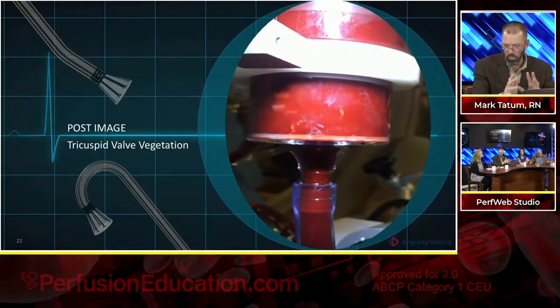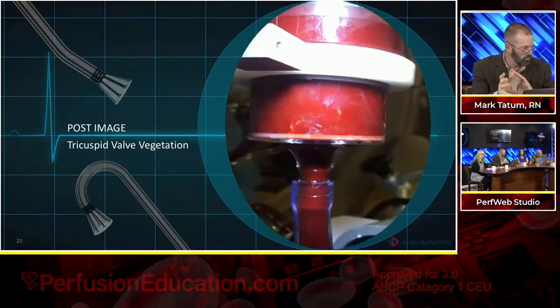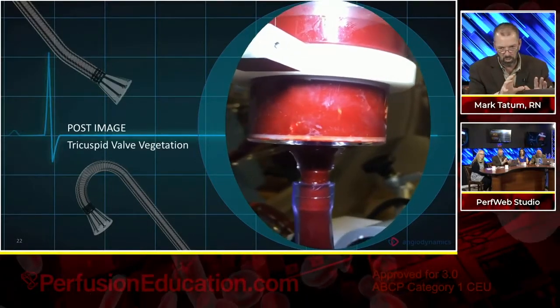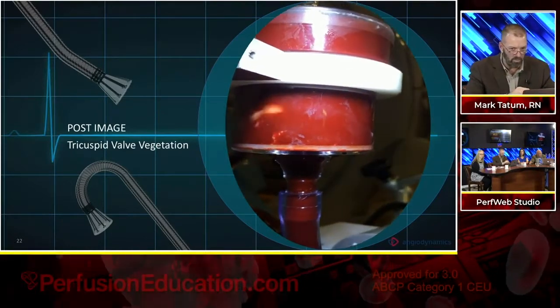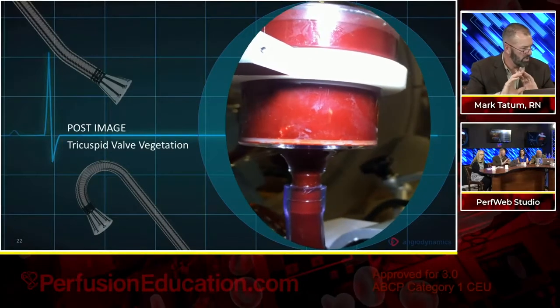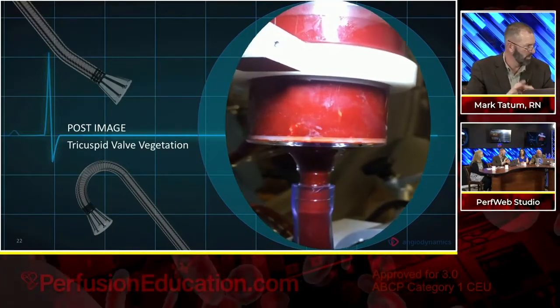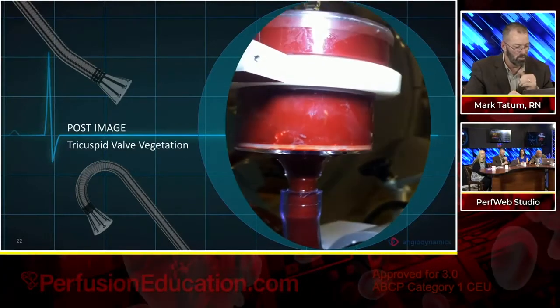We can talk more later offline or online at the end of the discussion about how to determine once your filter's full and what are some of the cues. But one of the things that you can even see on this image clearly is the swirl of blood within the filter. That is a huge cue. If we're not swirling, we're not flowing. If we're not flowing, we got to start investigating. So it's kind of where we sit on this.